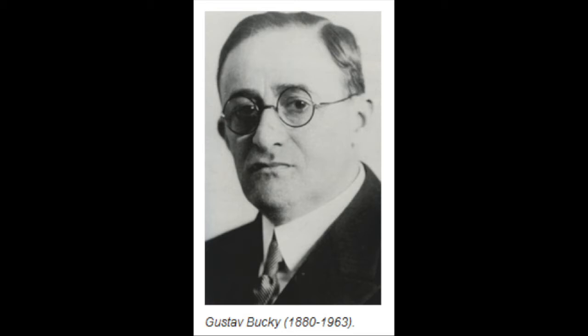Experts in the early 1900s were discovering that the images were becoming blurred due to scatter radiation. But it wasn't until 1913 that a German radiologist named Gustav Bucky invented the grid, which he placed between the patient and the IR. Because a grid is used to absorb the unwanted scatter, it is important to use a grid when the patient has a thicker, larger body part or with procedures that require a high kVp technique. In other words, a grid is used when the patient's body thickness is greater than 10 centimeters or when more than 60 kVp is applied.